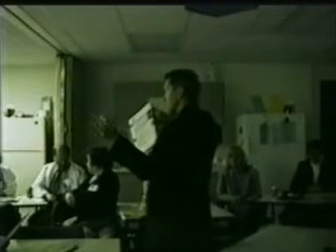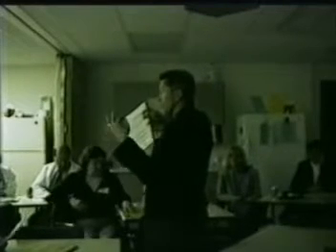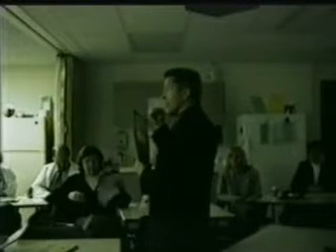If you look at the very top box, between the shaded dark blue areas, up here you're basically looking at your standard lipid profile, correct? Everybody see where I am? Okay. First advantage of that, though, as I've been talking about, it's not a calculated LDL. Everything with the VAP is directly measured, LDL being one of those, but all the lipid fractions with the VAP are directly measured.